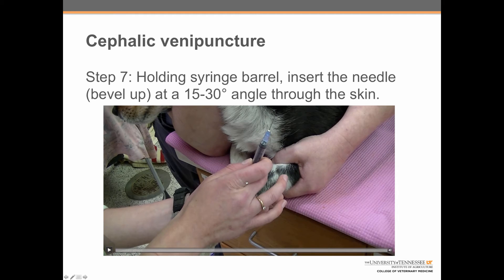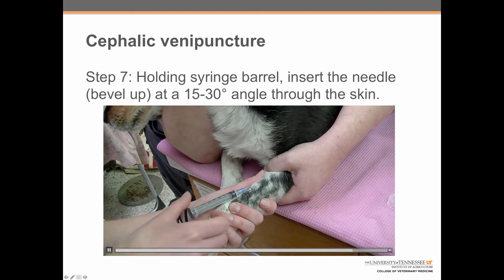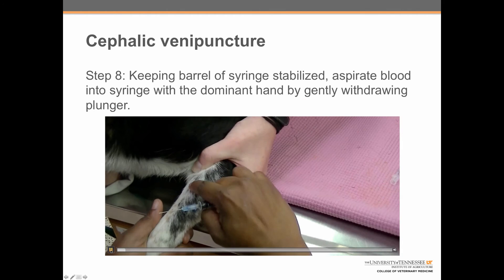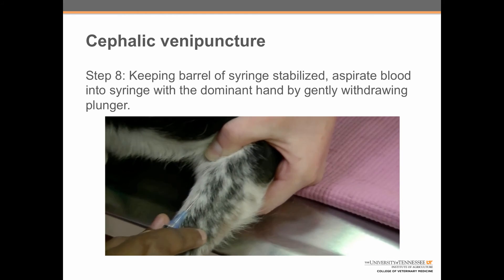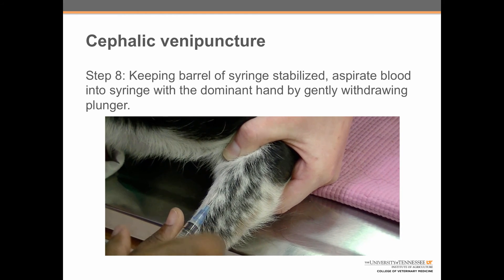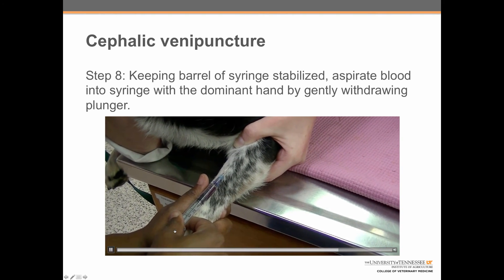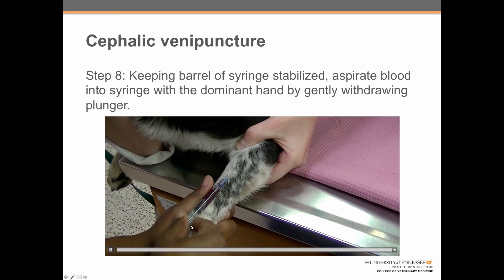Step seven: holding the syringe barrel in the dominant hand, insert the needle bevel up — slanty side up — at a 15 to 30 degree angle through the skin, then flatten it out once through the skin to best enter the vessel. Step eight: keeping the barrel of the syringe stabilized, aspirate blood into the syringe with the dominant hand by gently withdrawing the plunger. Here we can see Shanna pulling back gently on the plunger, with her thumb stabilizing the vessel and syringe as she draws blood.